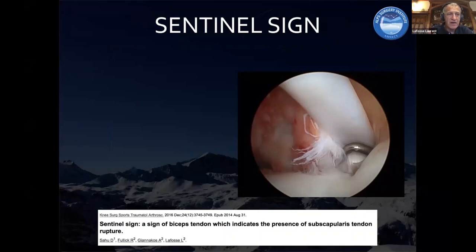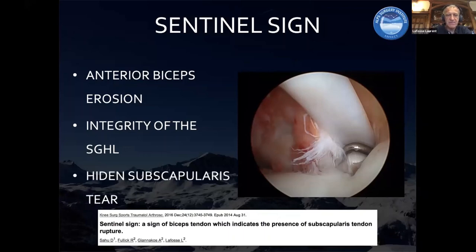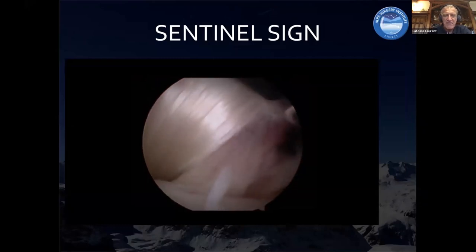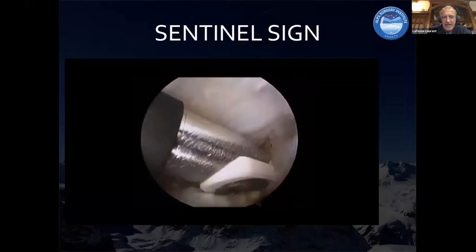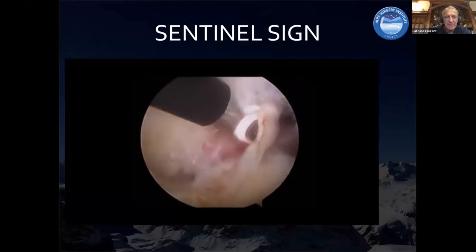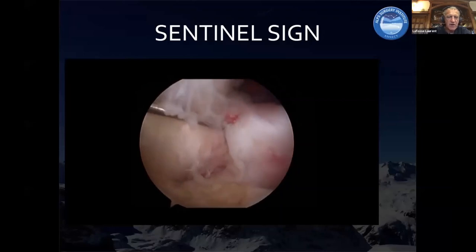This is something really new. If you have an anterior biceps erosion, and the superior glenohumeral ligament is intact, you may think the subscap is intact because the tear is hidden by the integrity of the ligament. We underlined this a few years ago. For example, here it looks to be an intact subscap, but you have a sentinel sign — an erosion of the biceps. If you cut the superior glenohumeral ligament, you will discover the subscap tear behind the ligament. The subscap is torn and this leads to a partial instability of the biceps, which causes erosion of the anterior biceps — tremendously important.